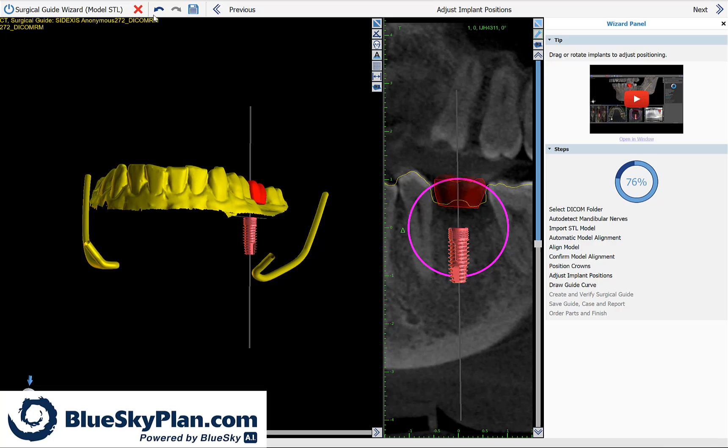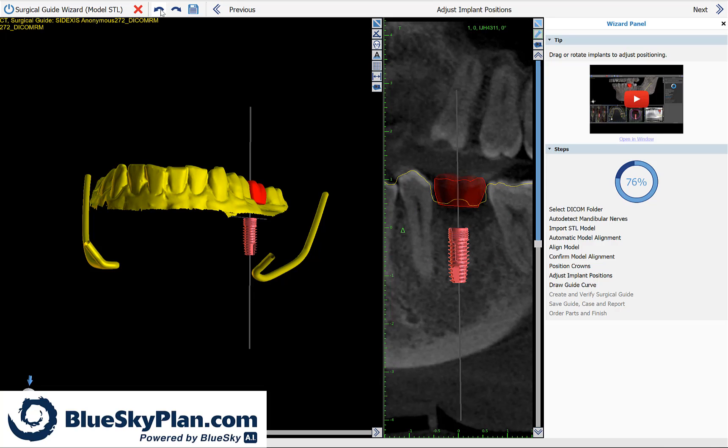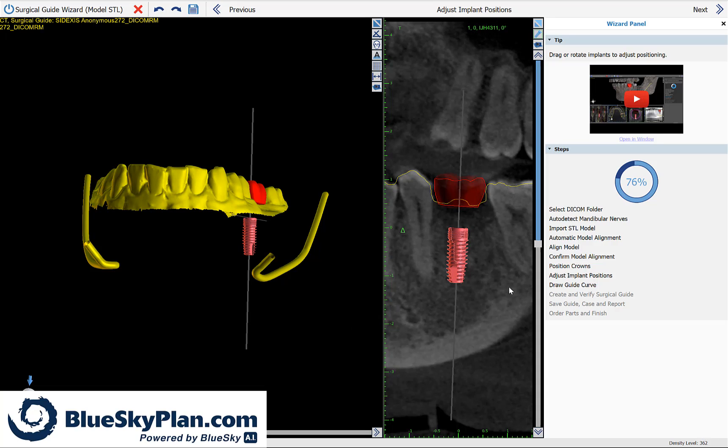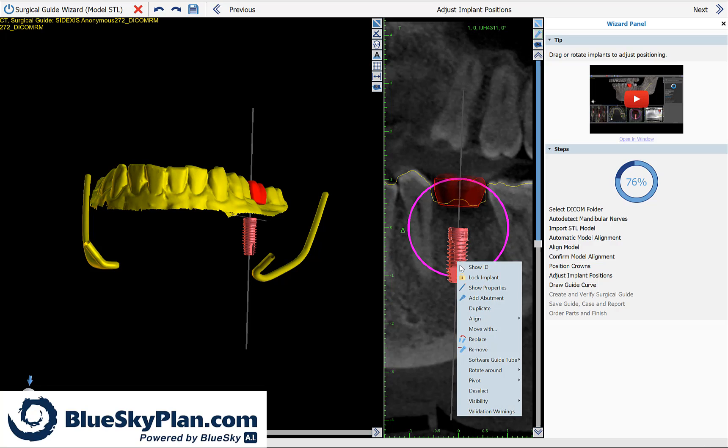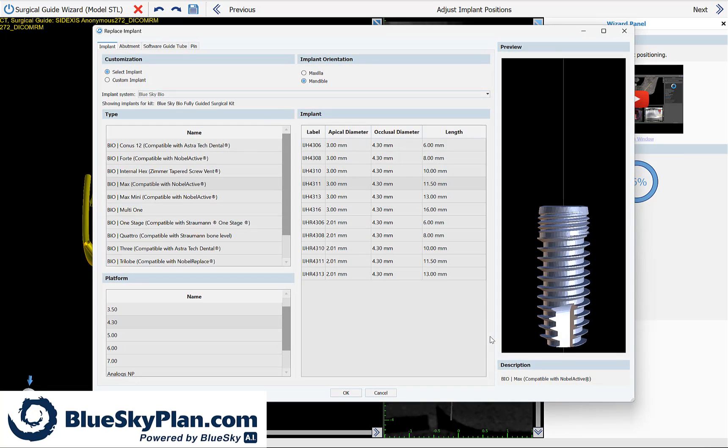I'm going to click undo to return the implant to its previous positioning. At this point also, if you decide that you want to place a different size implant, simply right click on the implant, choose replace, select the relevant implant system width and length, and then click OK.